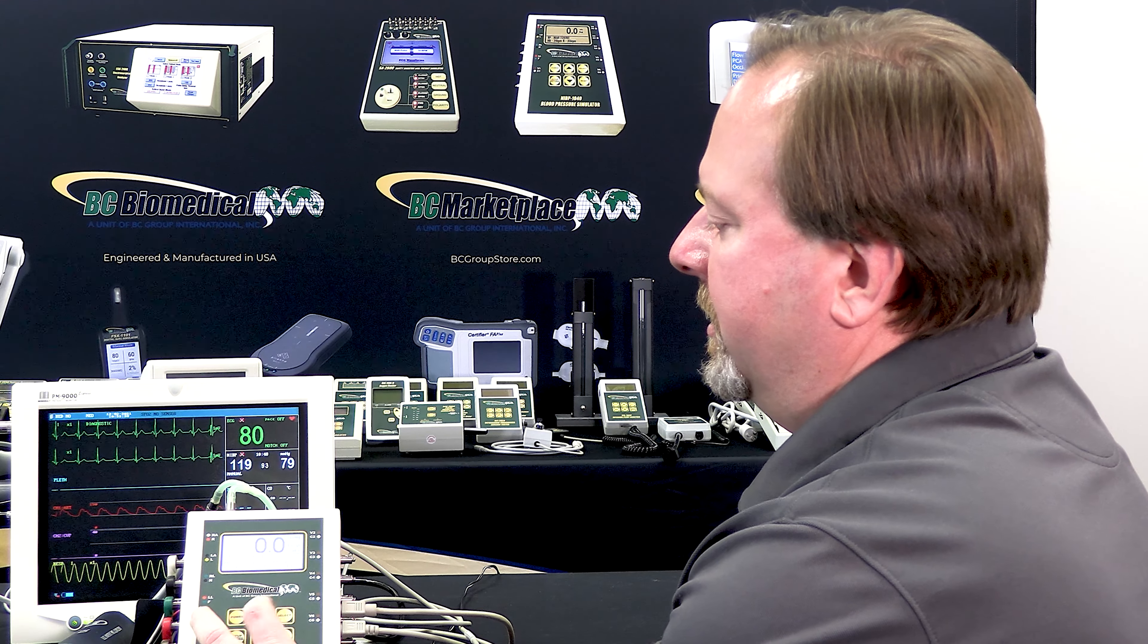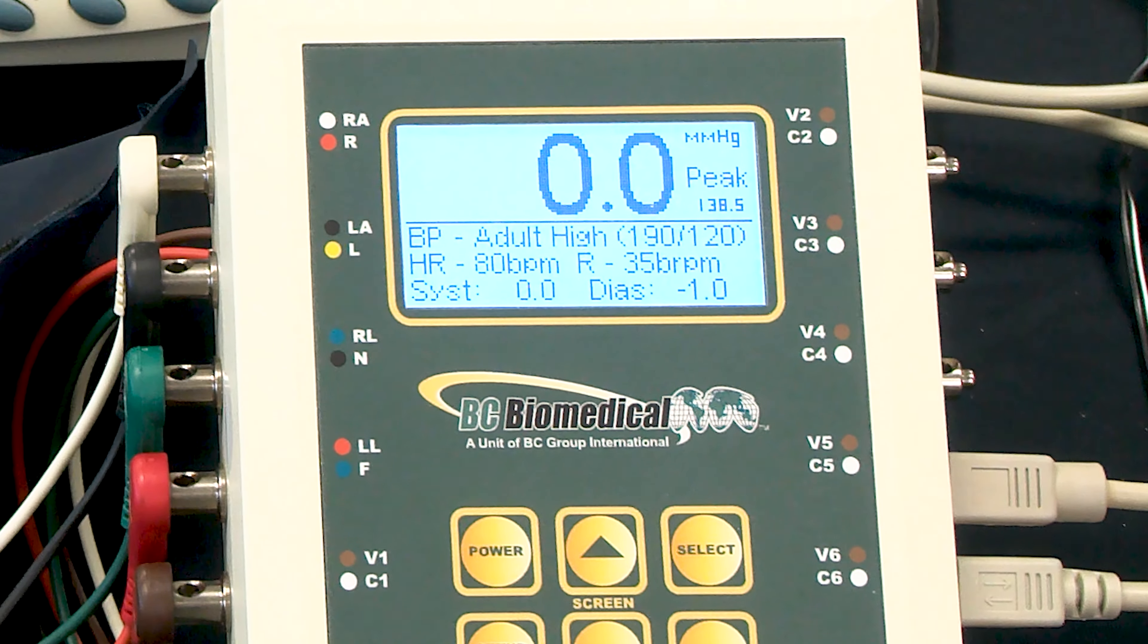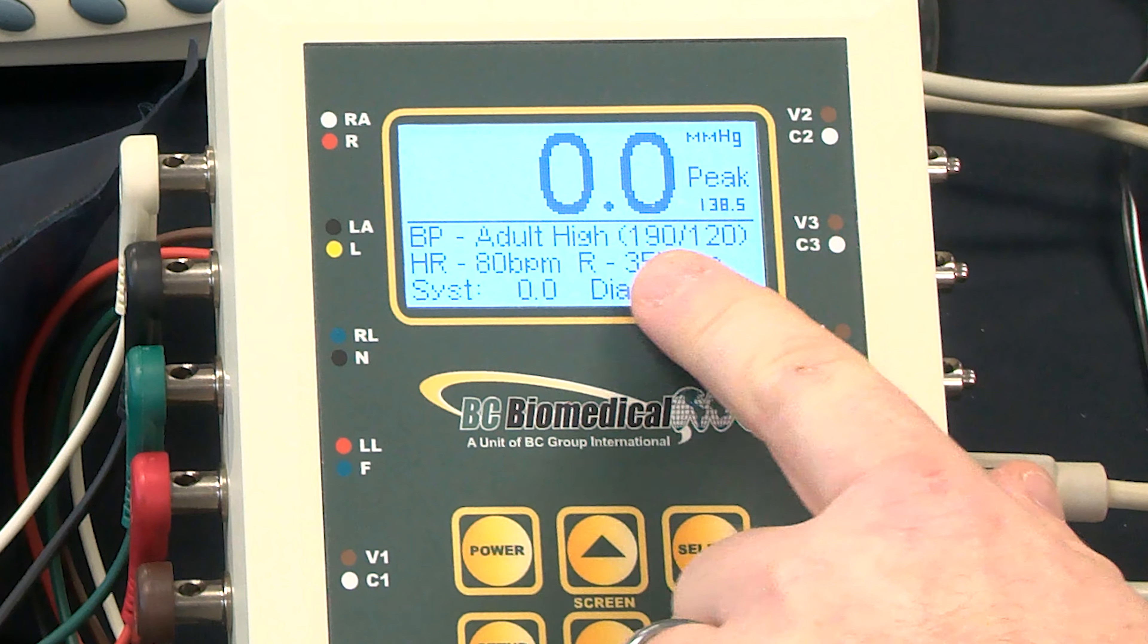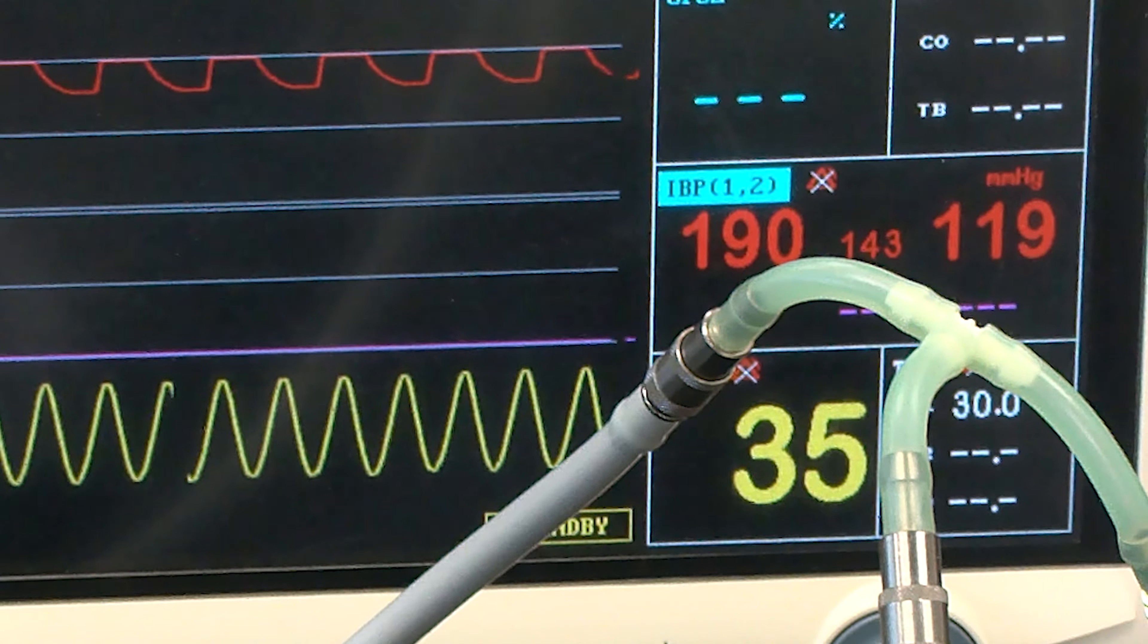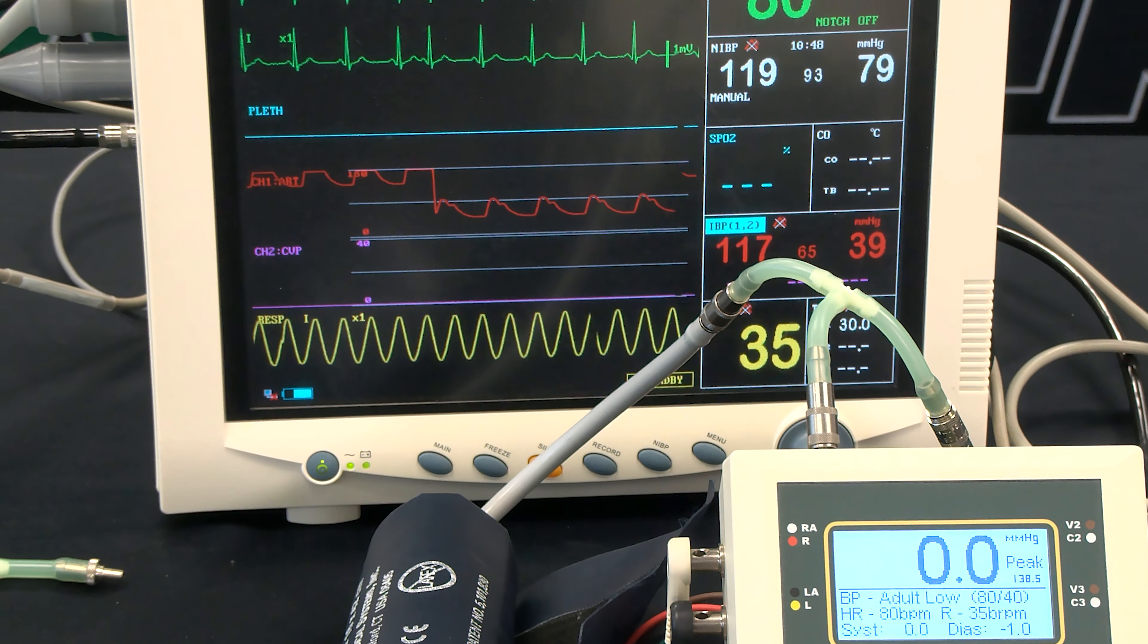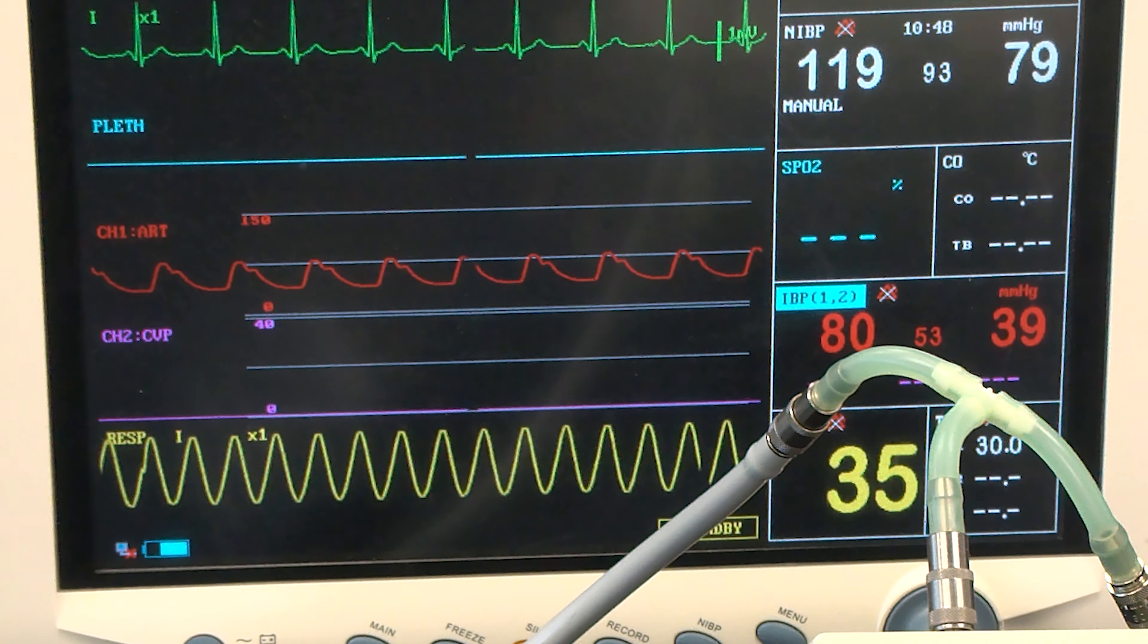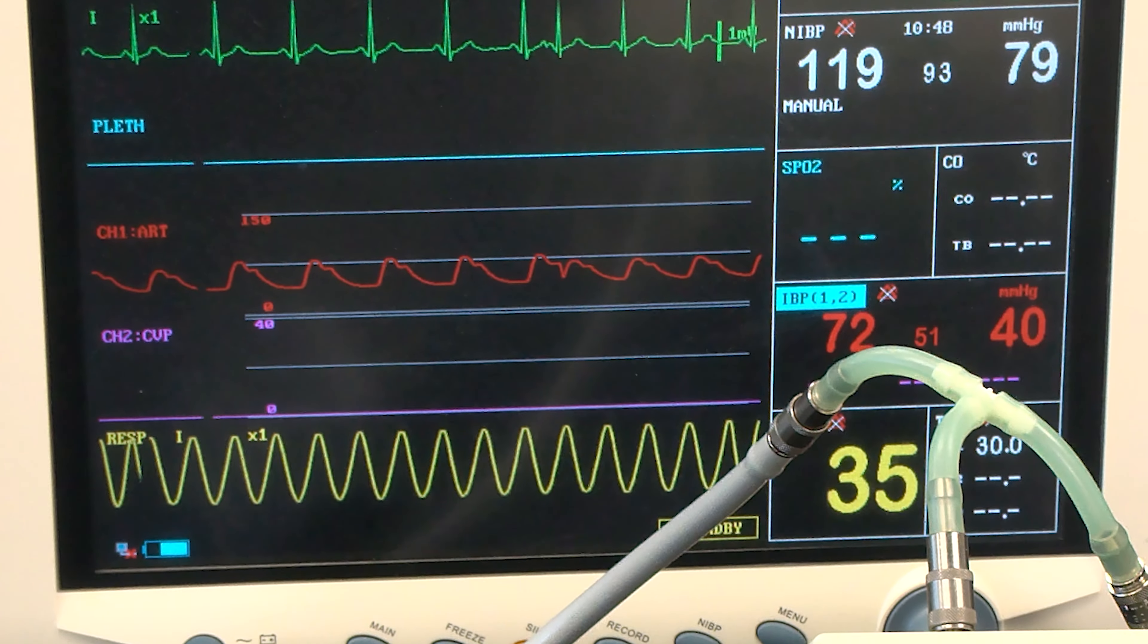We can change those dynamic settings by pressing the select button on the NIBP, and here we scrolled to adult high, and it should be 190 over 120, and we can see that reflected on the monitor here. We also have adult low, which is 80 over 40, and the monitor responds pretty quickly, showing us the correct reading there, and we also have 70 over 40.